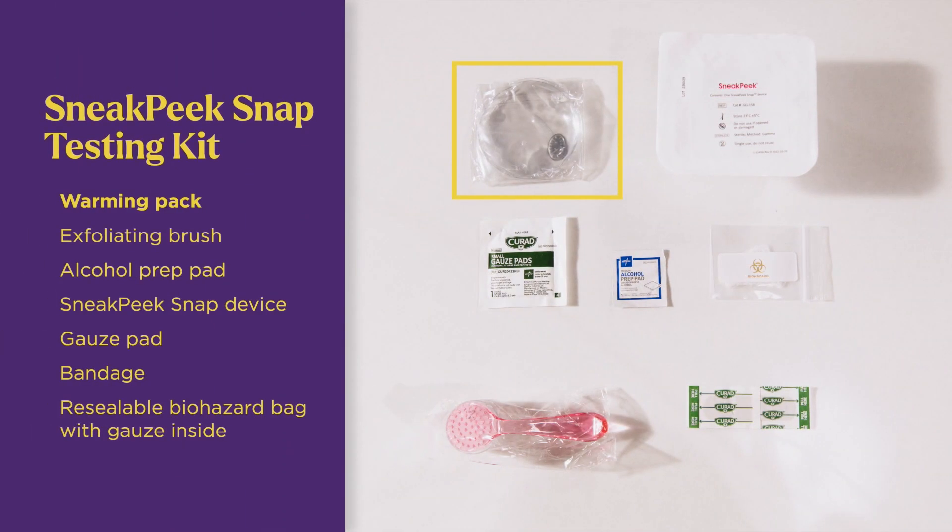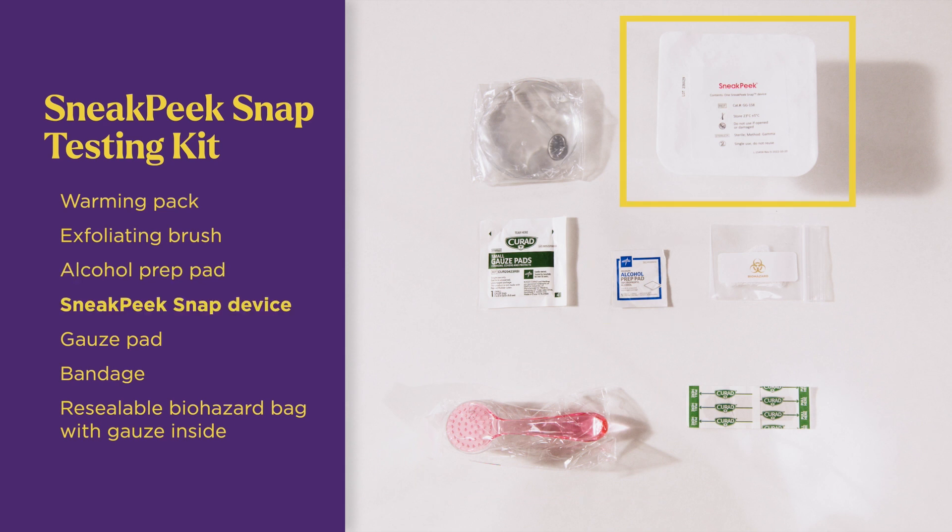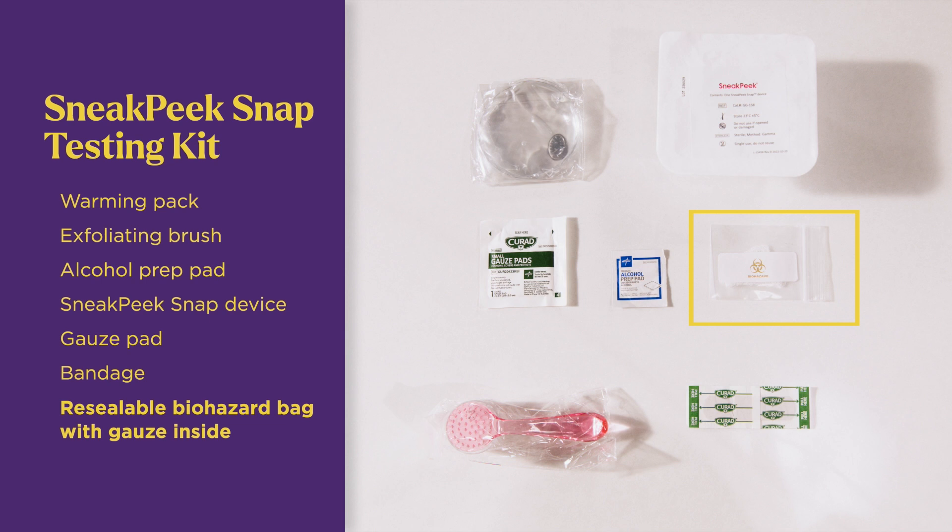Your kit has a warming pack, an exfoliating brush, an alcohol prep pad, the Sneak Peek Snap device, a gauze pad, a bandage, and a resealable biohazard bag with gauze inside.